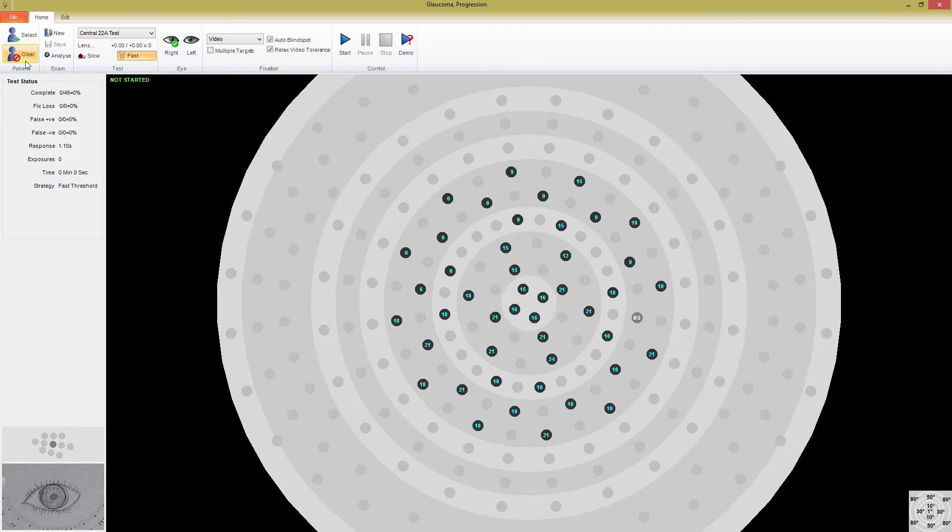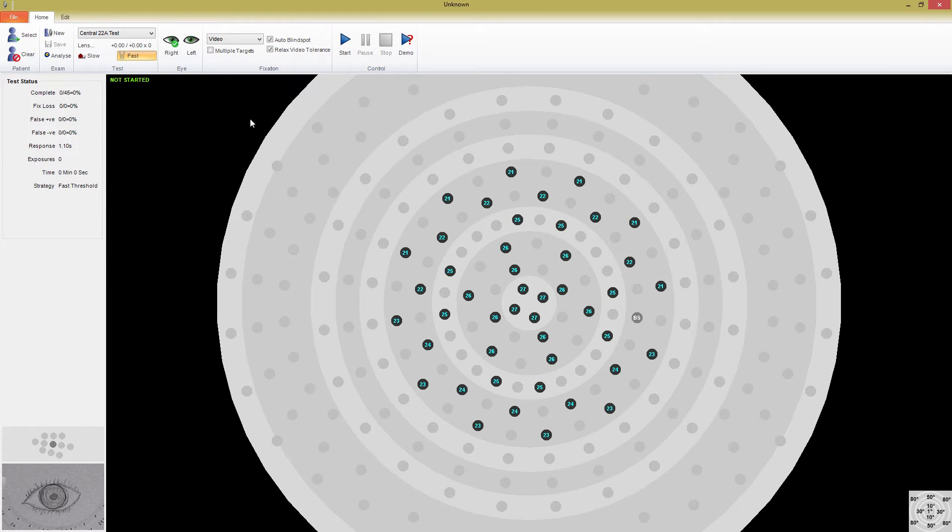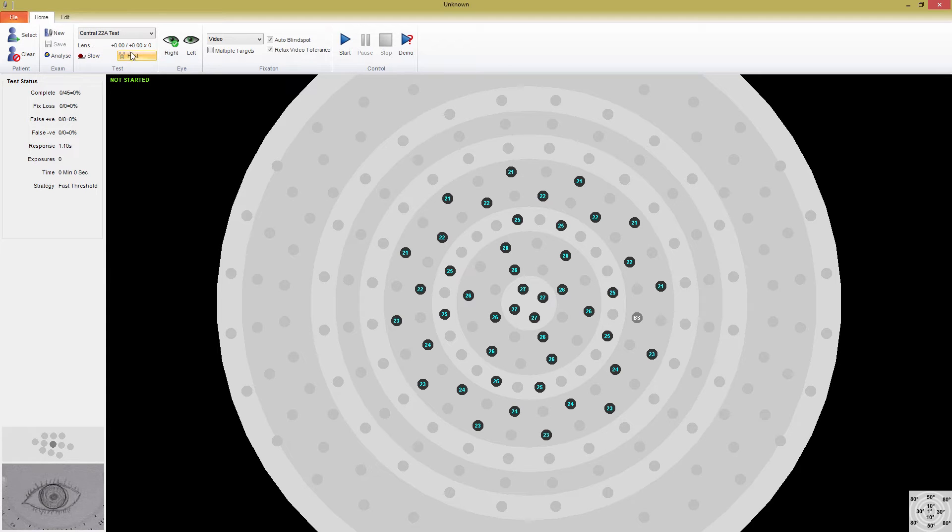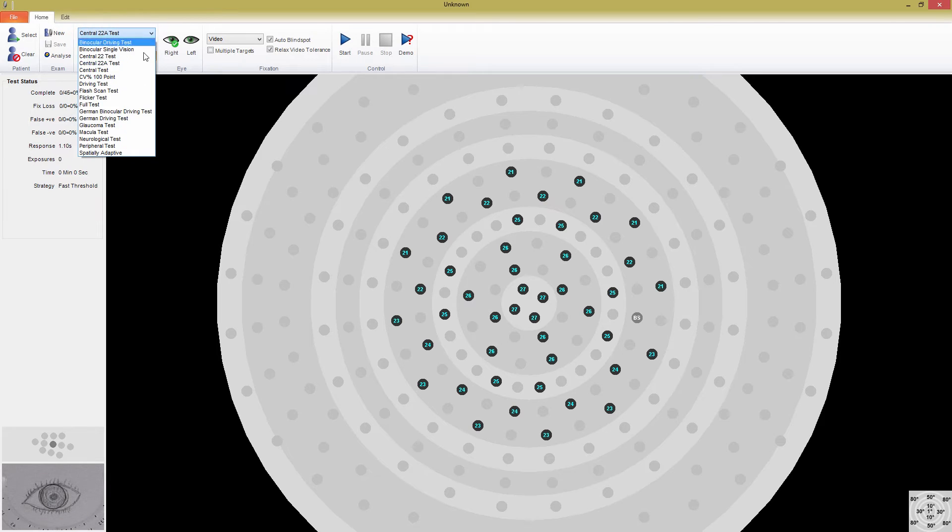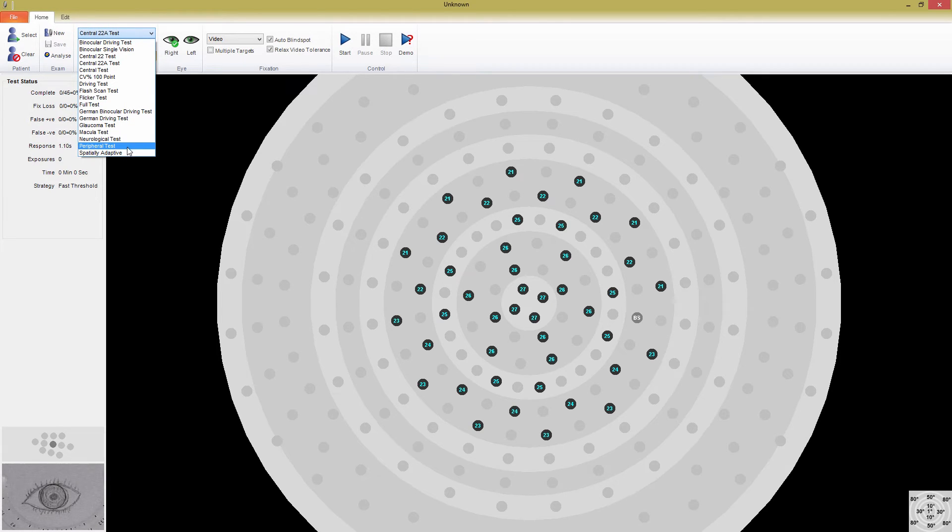However, if you want to save the exam, you will have to choose a patient at the end. To get started with a test, the first thing you need to do is select the test template you want to use. Click on this drop-down list, and you will see all of the built-in test templates. I'm going to do a quick test using the Central22 test template. Make sure you have the correct eye selected, and have chosen the type of fixation monitoring you want to use.